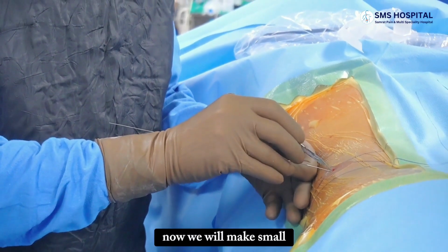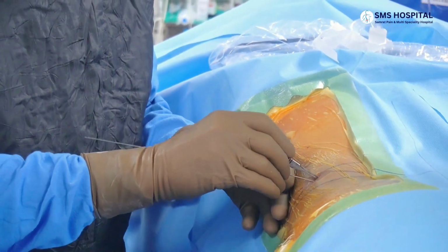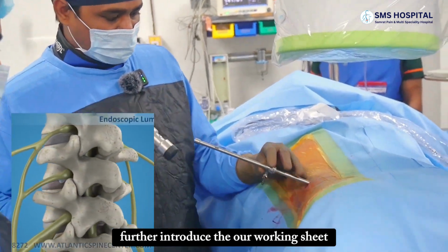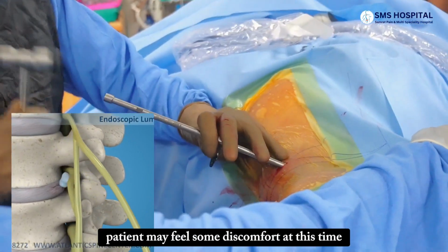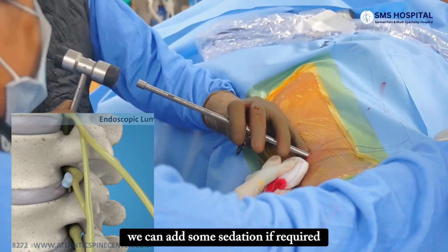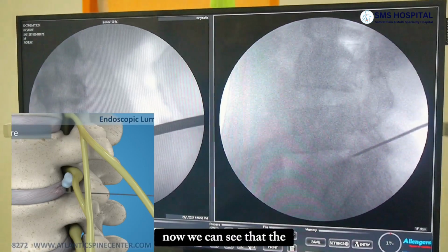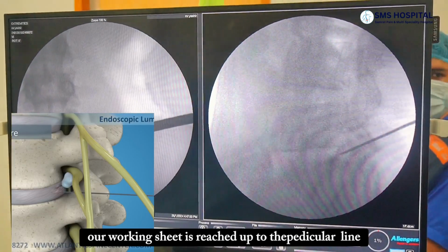Now we will make a small stab incision in the skin and subcutaneous tissue. Further, we introduce our working sheath. The patient may feel some discomfort at this time. We can add some sedation if required. Now we can see that our working sheath has reached up to the pedicular line.